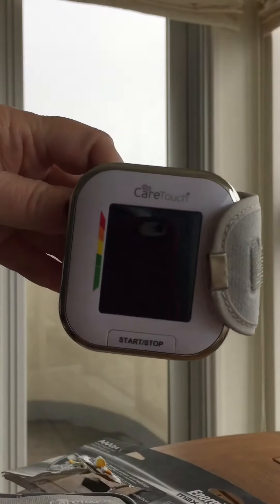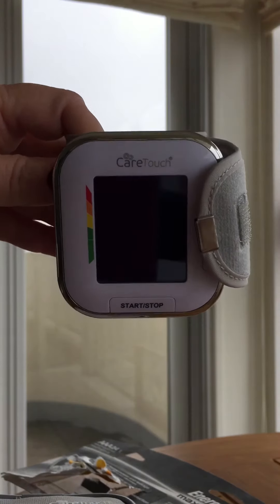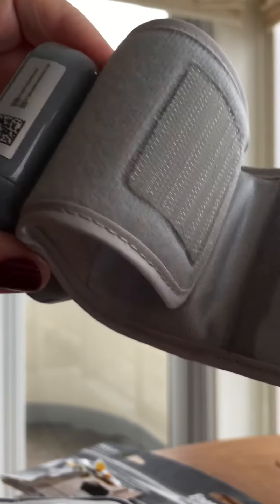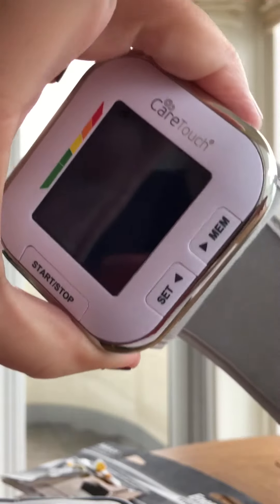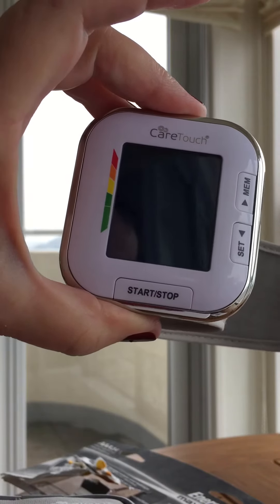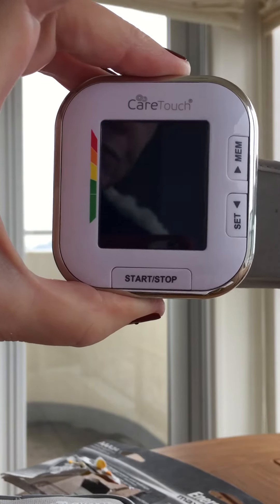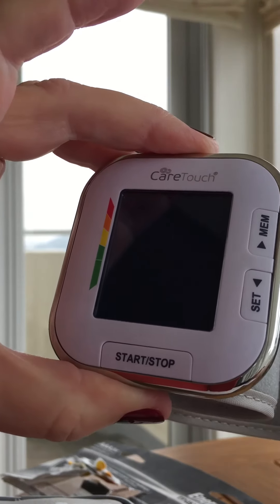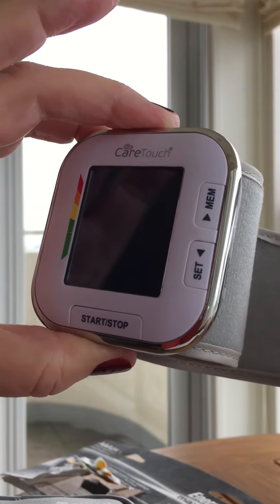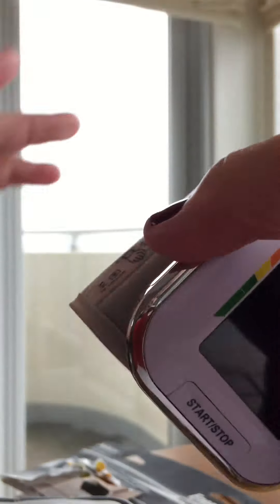I really like this CareTouch wrist blood pressure monitor — it just zips right on. I would highly recommend it, especially if you're trying to take your blood pressure all by yourself. It really is easy to use and it helps me stay on track and watch my blood pressure levels.